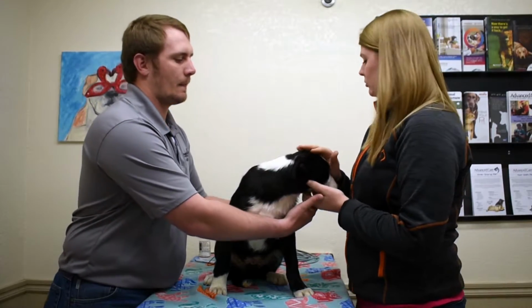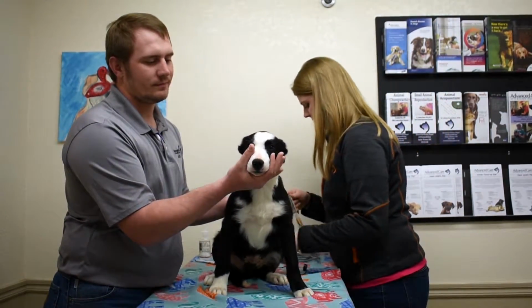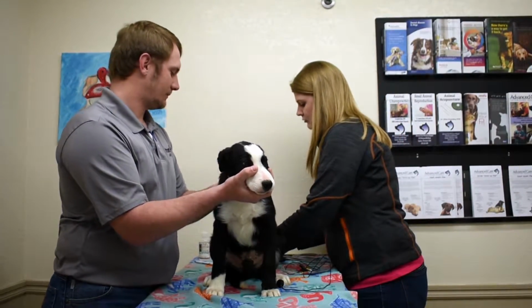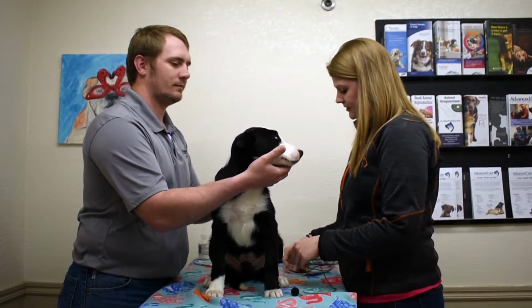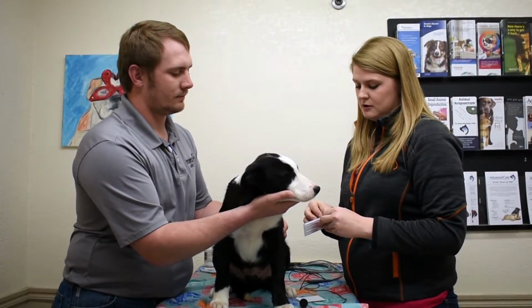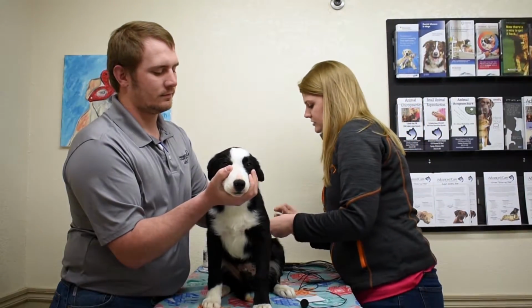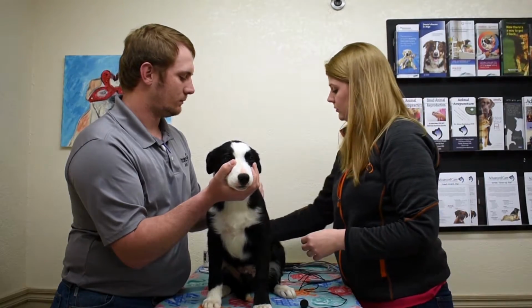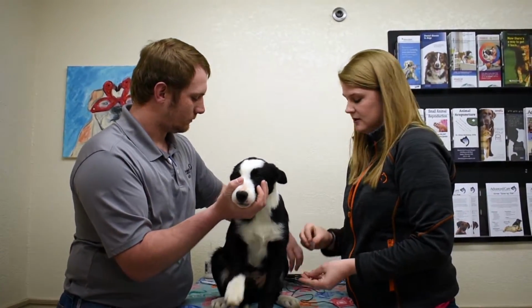So Justin's going to help hold Woodrow. This is actually Justin's puppy Woodrow here for our exam. He has not had any testing done before, so this will be a good example of how a puppy might react. Some of them are really tolerant and others need a little bit of time. We use acupuncture needles to place the leads, so the leads will attach to those needles. And then once we have everything placed, we hook up all the wires and make sure everything's working okay, and then we record the test.